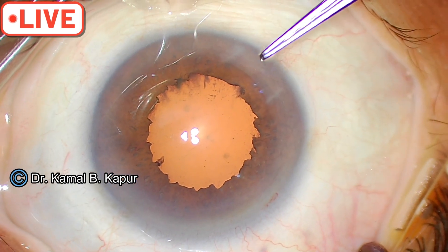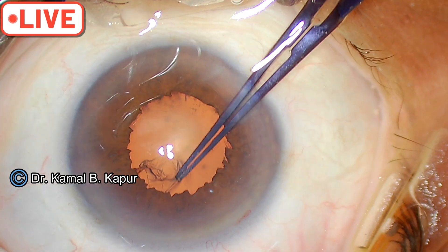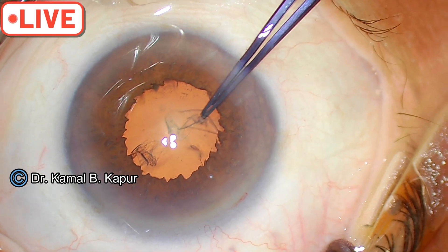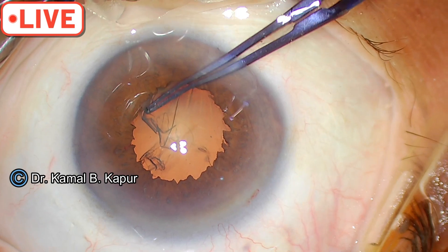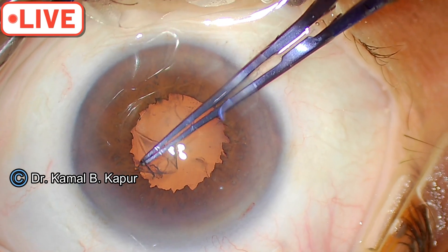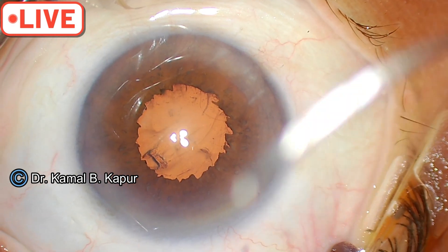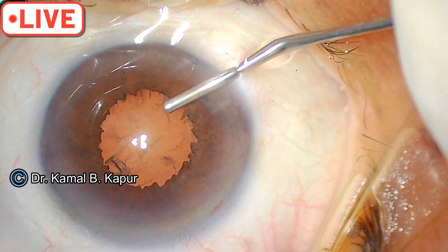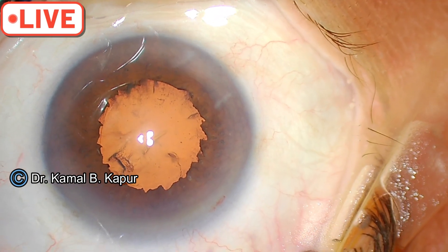Now the only thing to remember is when you are doing your phaco procedure, stay away from these tags of the pupil — you might end up pulling them. Make sure you do your capsulorhexis as near to the margin as possible, because the whole purpose of doing this is to have the largest possible visible capsulorhexis. That gives you a very decent-sized pupillary opening.